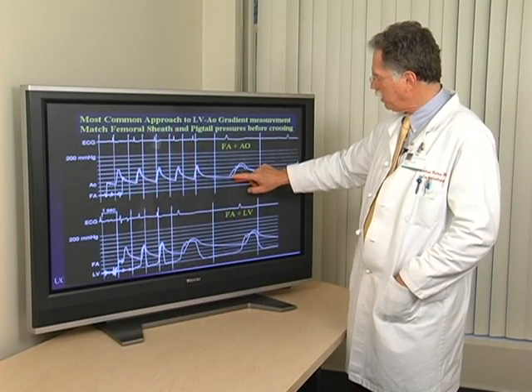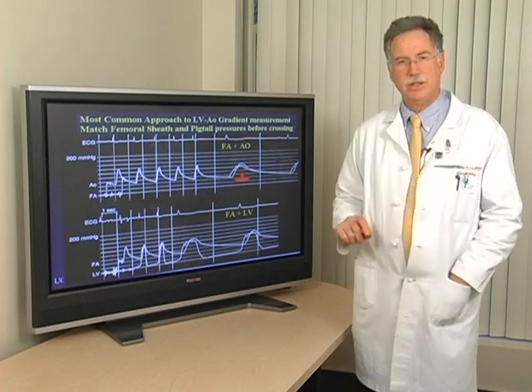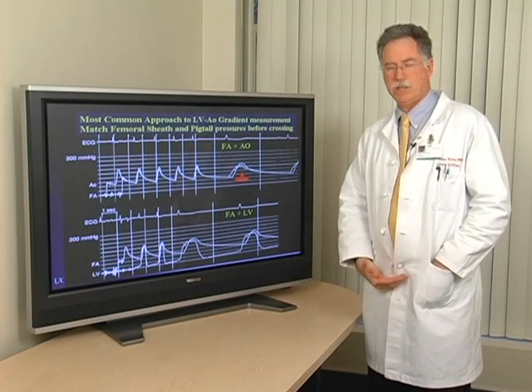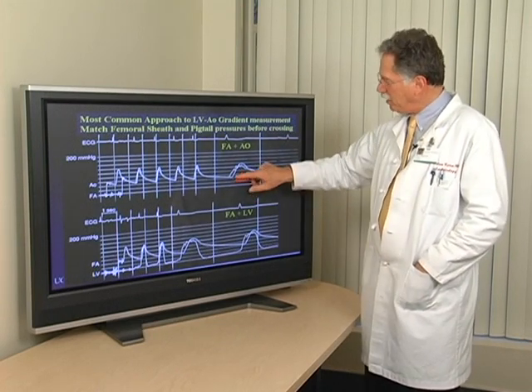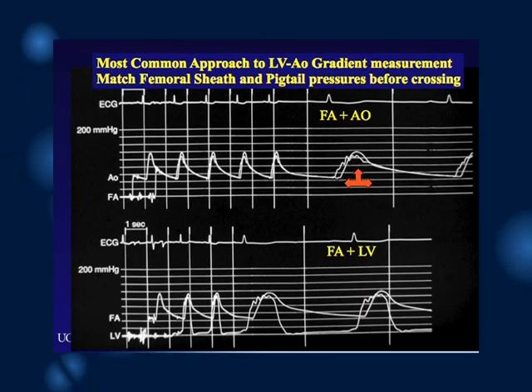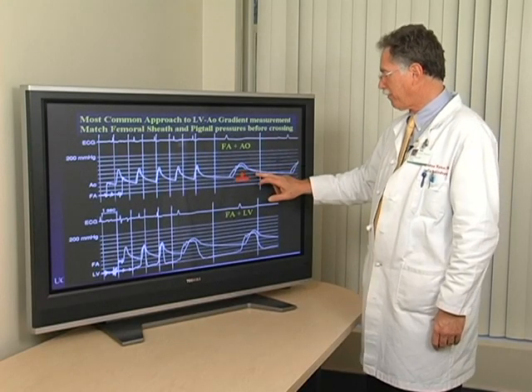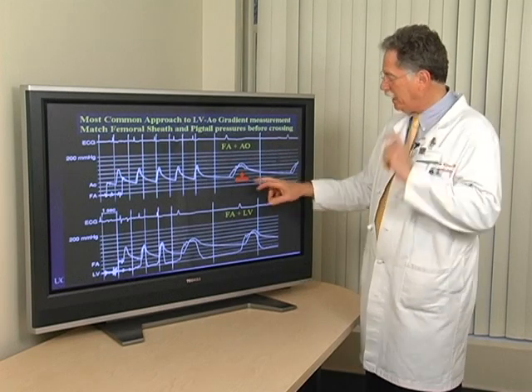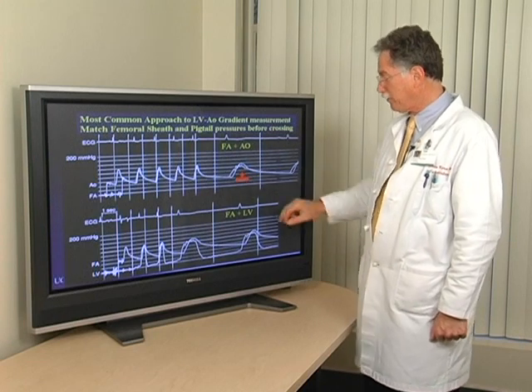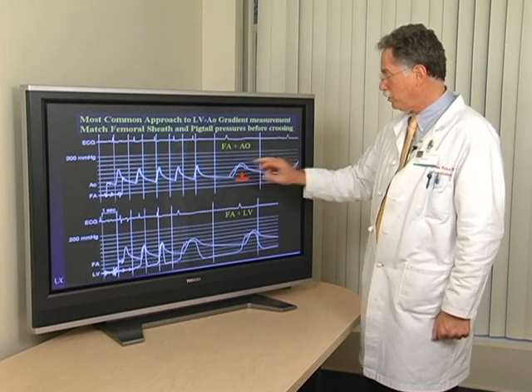So the first pressure up would be a pigtail pressure in the central aortic position. The second pressure up would be the pressure measured as it arrives at the femoral artery, and it often has an overshoot which has summation artifact. So femoral artery pressure is higher than aortic pressure, and it's due to the elastic recoil of the vascular system whose pressure waves summate and cause this resonant artifact. This is a normal relationship, and in some cases it becomes great. In young people it can become higher, in aortic insufficiency it can become higher, but you should look for this.